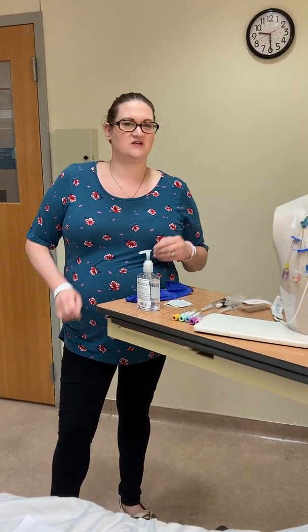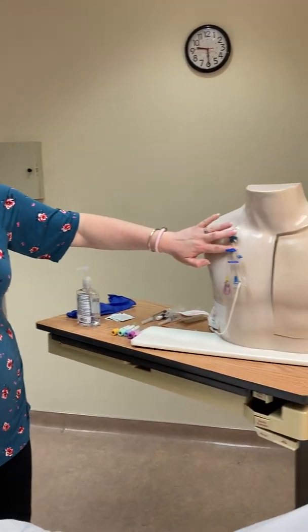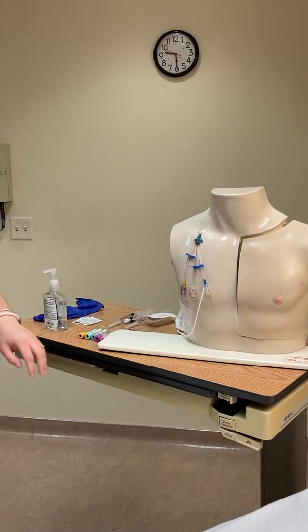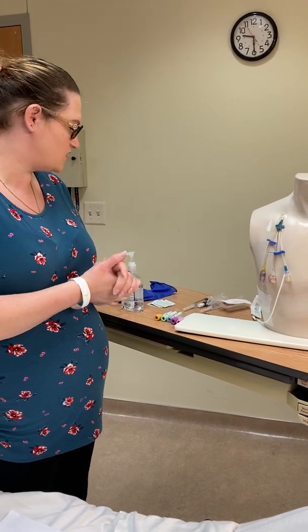For this video we're going to do a central line blood draw through the central venous access device with our triple lumen. There are some things that we need to have before we get ready to draw the blood.